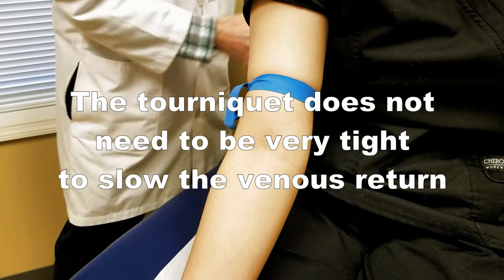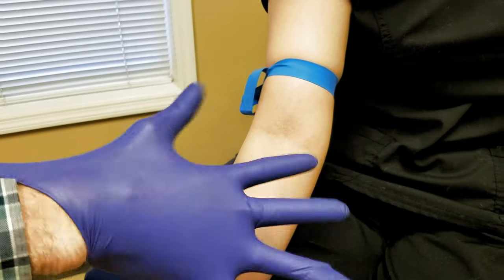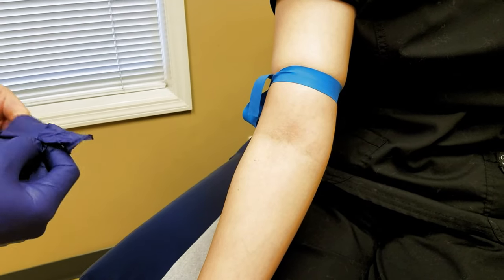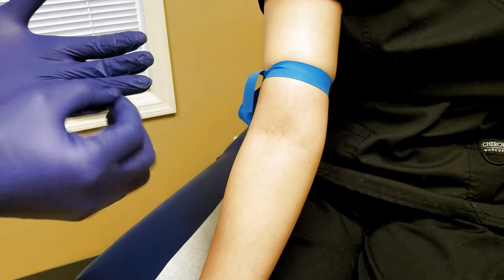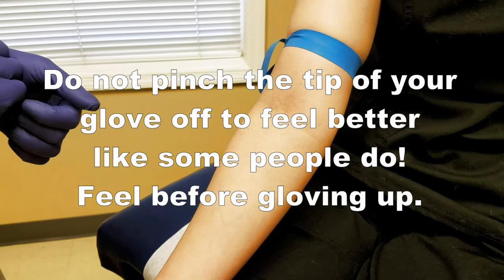Always put your gloves on. You don't have to, but you can't feel as much, so if you can't see the vein, you'll want to mark the vein. But we can see it and we know exactly where we're going.